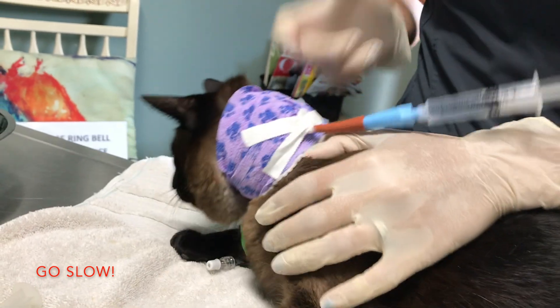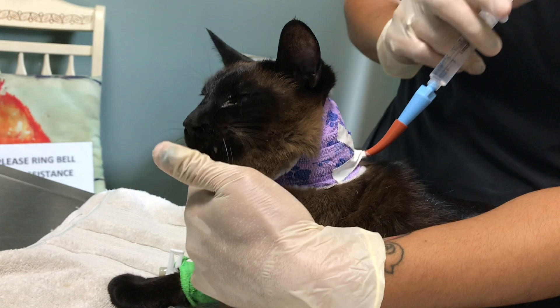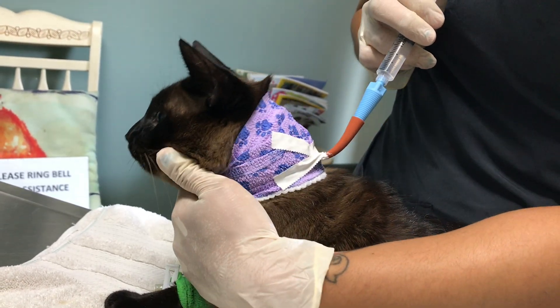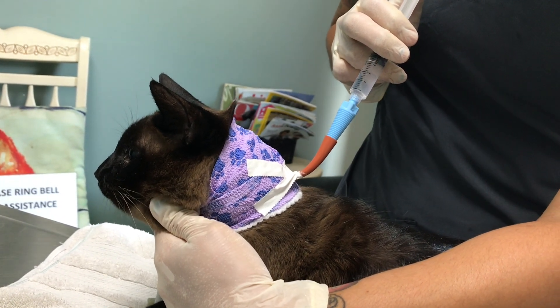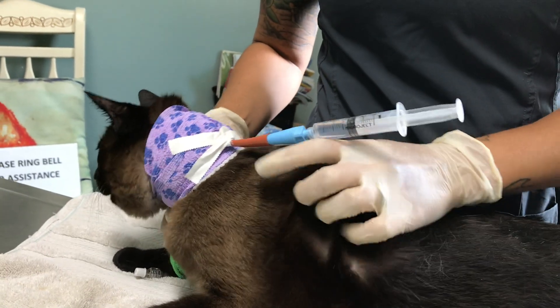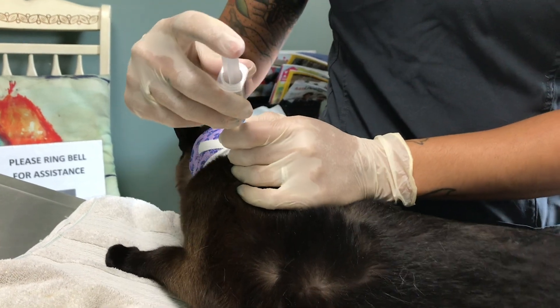What we like to do is administer the food and water about five mils every one minute or so — we just don't want to do it too fast or too slow. As we all know, cats can get a little impatient and don't want to sit for too terribly long. But they tolerate it pretty well; as long as he's not coughing or sneezing, we know that he's doing pretty well with it.